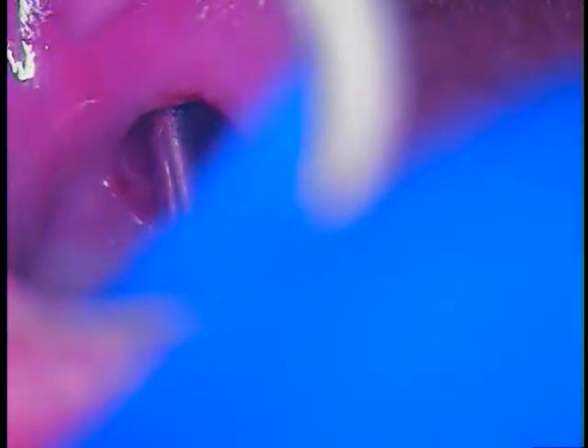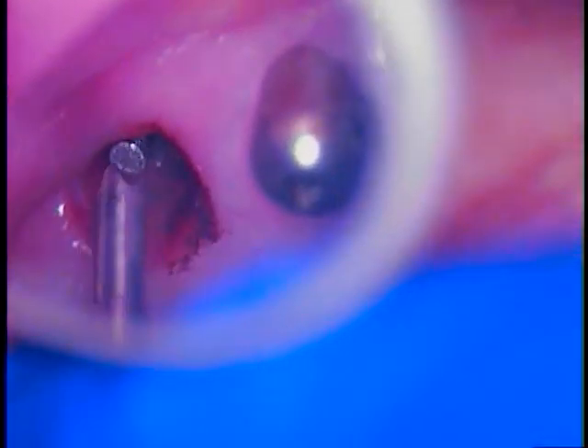We have our parts ready. Take my fork driver, go right back in place, grab a hold of that and just untwist it out — it's that easy. Don't go in there with a three-quarter round bur or a 330 or whatever; you don't need to use any rotaries, just hand twist.